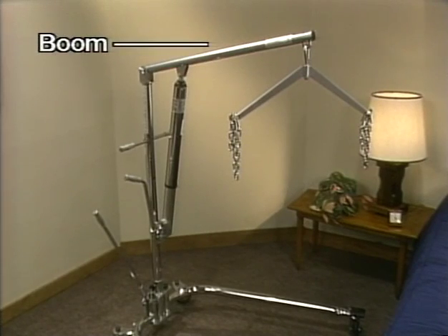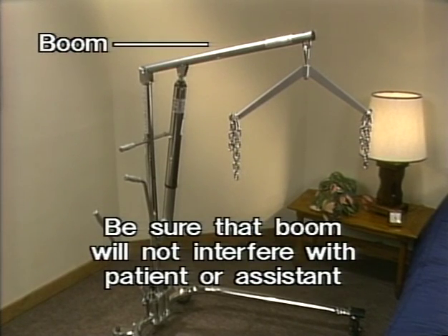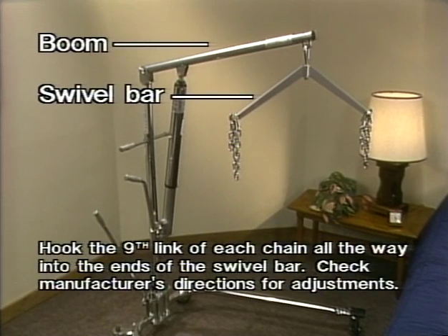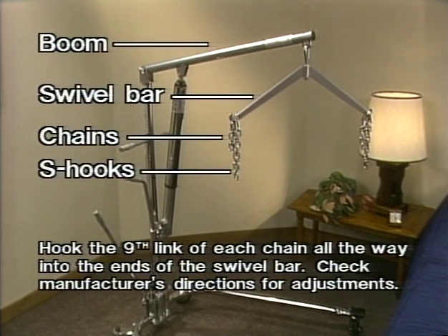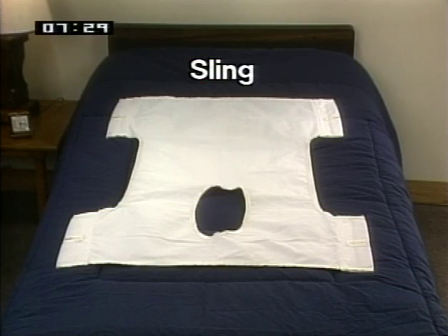The boom is the part of the lift which moves up and down. Always be sure that the boom will not interfere with the patient or your assistant when operating the lifter. The swivel bar attached to the boom holds chains which are detachable. The end of the chains have S-hooks which attach into the sling. The sling serves as the seat for the patient during the lift.